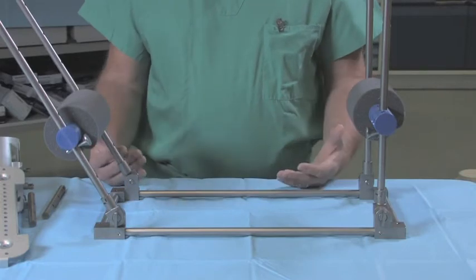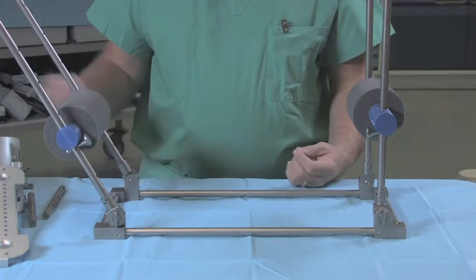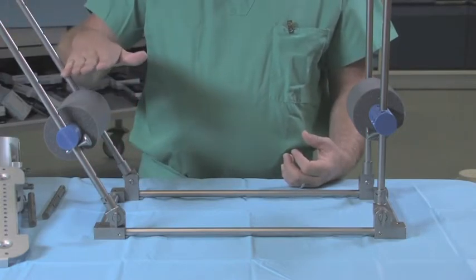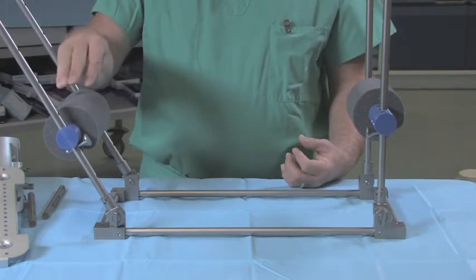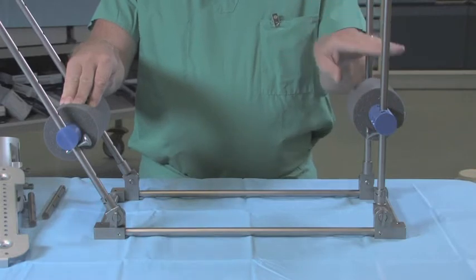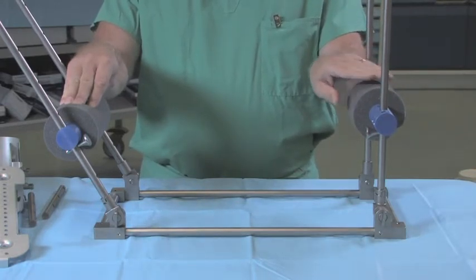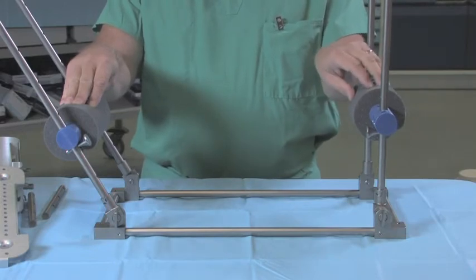Mechanically, the way that the frame functions is a lever and traction system. The weight of the body becomes the counter traction by flexing up the hip and laying the femur against this blue support bar, which actually acts as a fulcrum. We can then apply traction through the ankle and foot, either through skeletal traction, manual traction, or by attaching it to the distal foot attachment.